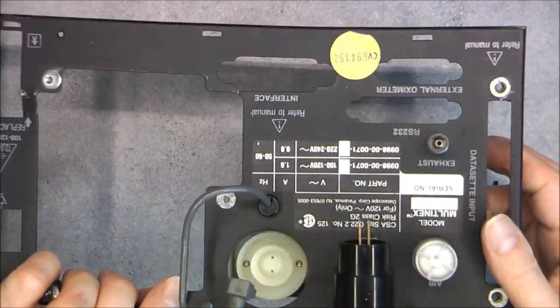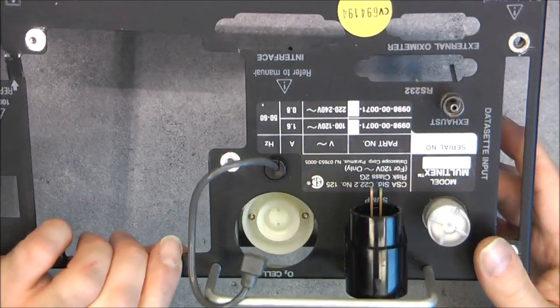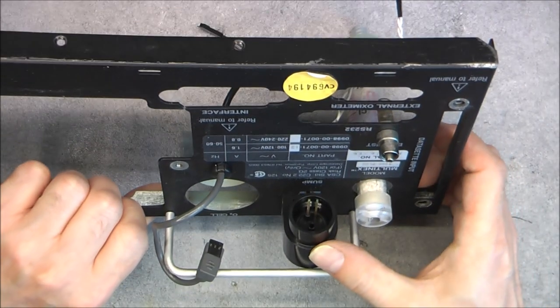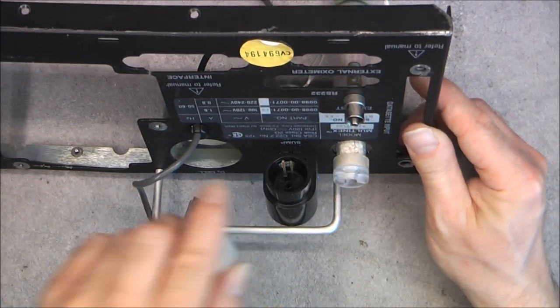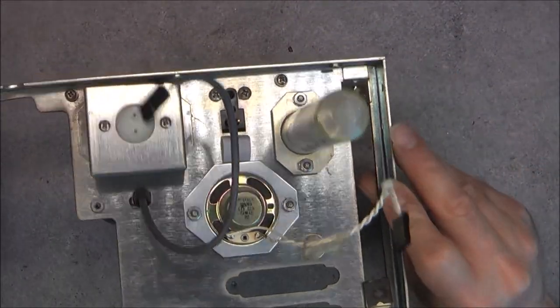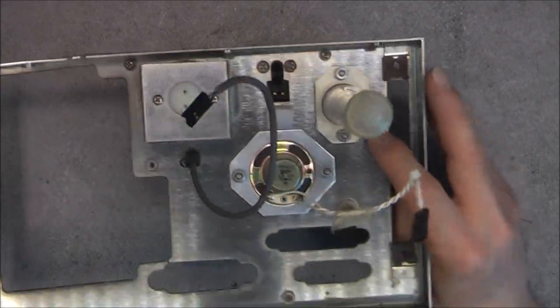It is mounted onto this little mount with its connection. Here, your sump, it is called receptacle, in which we add the little bottle with the two electrodes for sensing the level. Exhaust port, little alarm speaker, and that is all. So I will finish cleaning this off camera. You do not need to see me doing any more scrubbing on here.